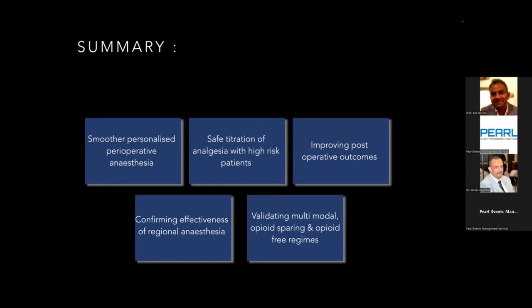these are the areas that I feel NOL monitoring will help us going forward. It allows us to give a smoother, personalized anesthetic technique, safe titration of drugs, improve post-operative outcomes, confirm the effectiveness of our regional anesthetic techniques, and it'll help us to validate multimodal and opioid sparing and opioid free regimes moving forward.